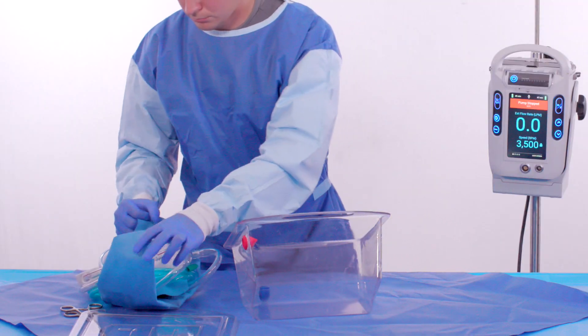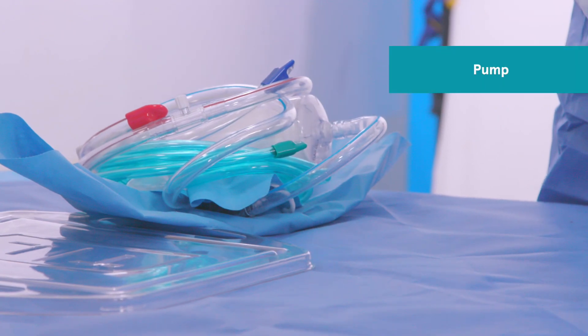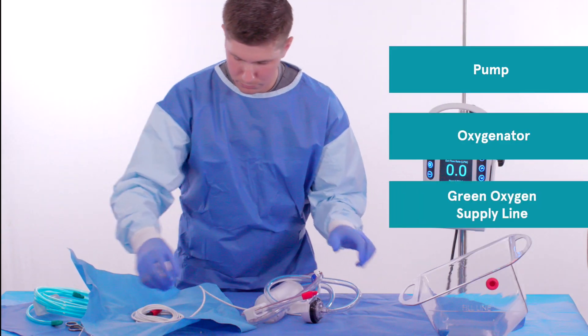Next, the sterile operator removes and separates the contents of the priming tray: the pump, oxygenator, and green oxygen supply line.